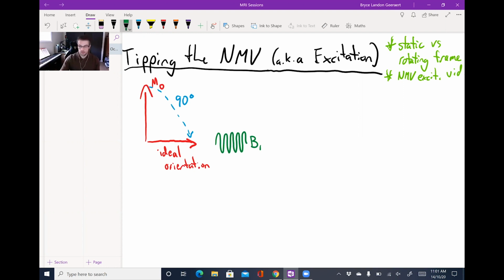And this is relevant because this is all fine and dandy, except as soon as the net magnetization vector is oriented off vertical, it's going to begin to precess, just like the hydrogen atoms that are off axis and aligned. So I'm just going to start drawing that here. We have our original orientation of the net magnetization vector. I'm actually just going to switch this to NMV so that we're consistent across the slides. Sorry, everybody. And we have our B0 field that's oriented vertically as well.